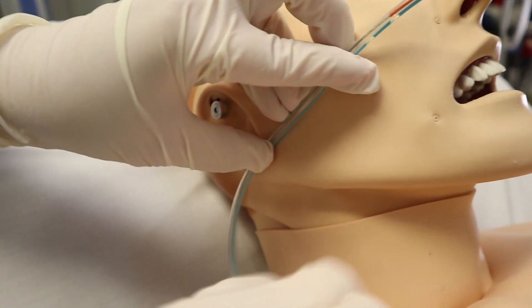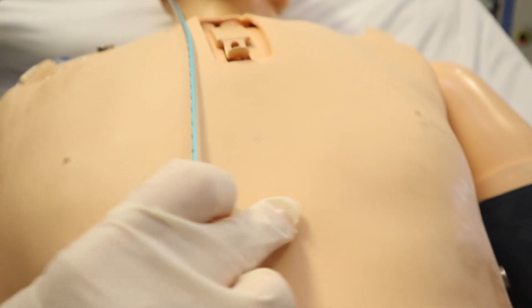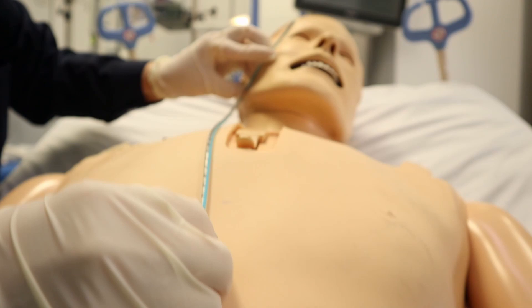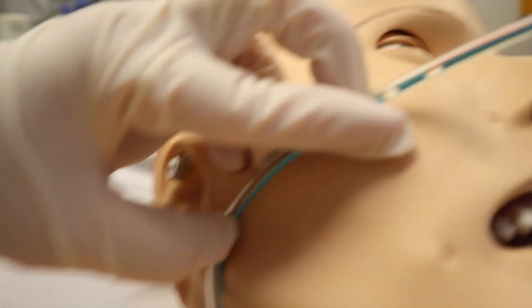It may be better to insert an orogastric tube for intubated patients. To estimate the length of the tube to be inserted, measure the distance from the tip of the nose to the earlobe, then from the earlobe to the xiphoid process, and add 10 cm for adult patients. For the orogastric tube, measure from the mouth to the earlobe to the xiphoid — not from the nose.